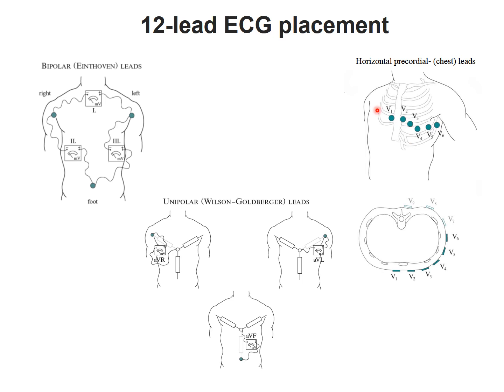This way, the 12 leads ECG can be used very well to diagnose anything that's happening in the heart.